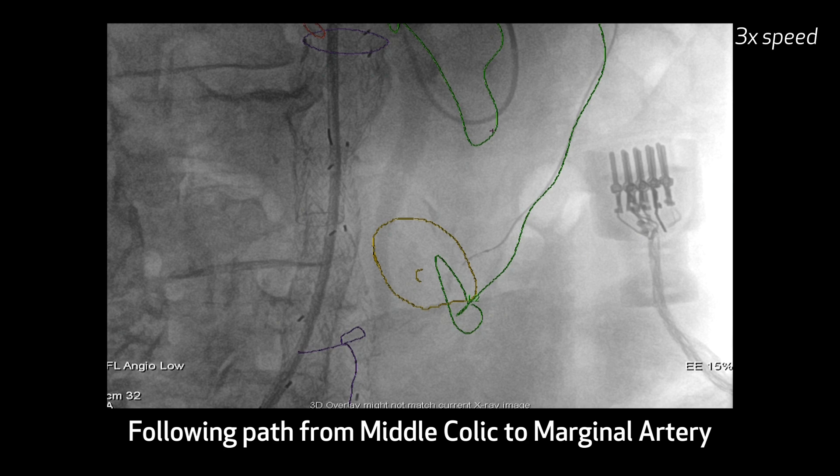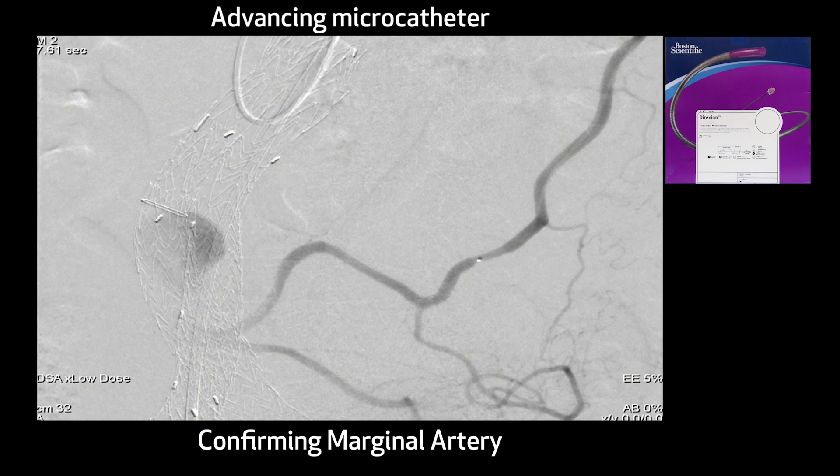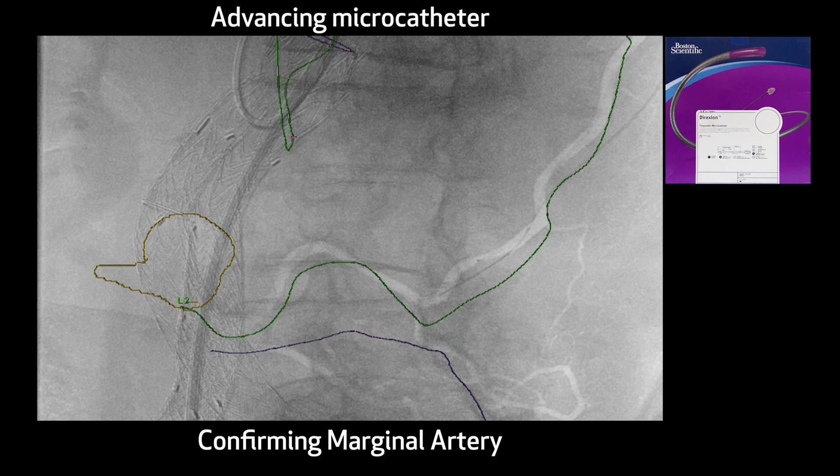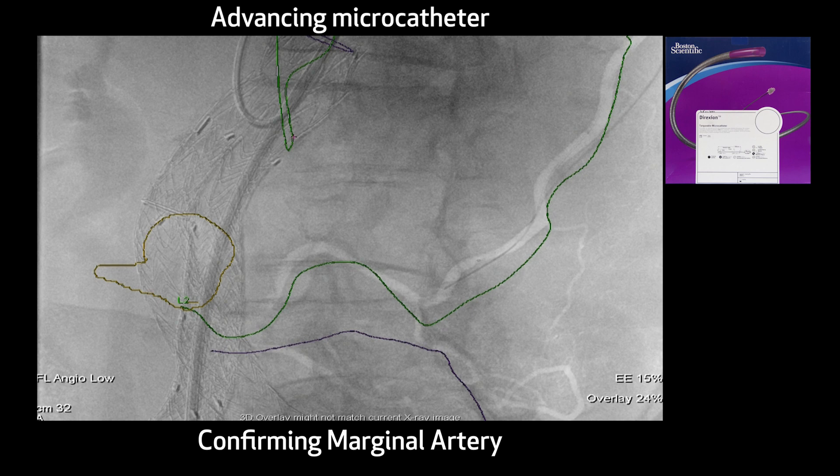Here we are now, and we changed the angle throughout this so that we can optimize where the various different side branches come off, so we know whether or not we're engaging them. Again, you can see these side branches. We're going to advance the microcatheter with its wire towards the yellow, which is where we've drawn in the endoleak cavity inside the aneurysm.